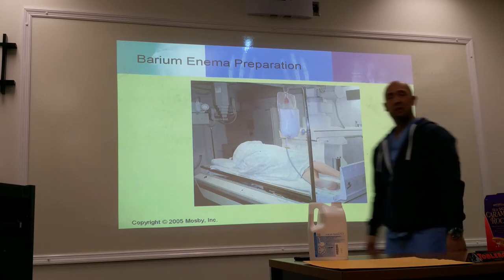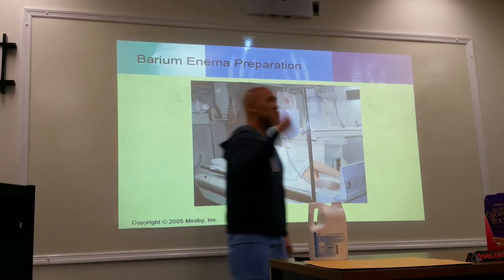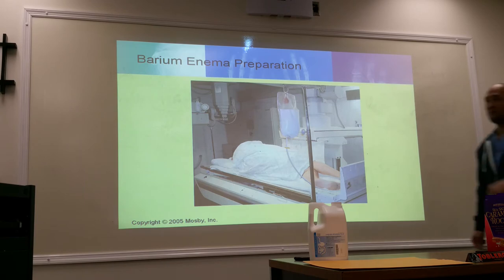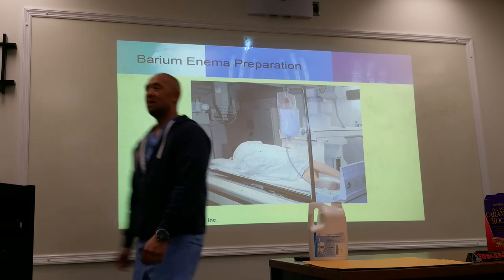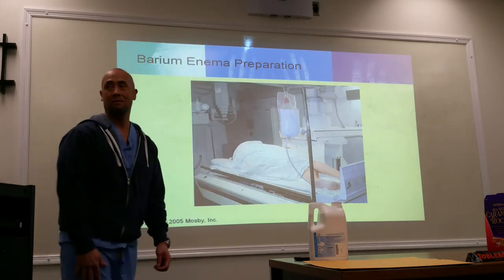Isn't it easier if you just pinch the tube? Yeah, you can do that. But are you really completely clamping it off? I've done that in the past too, and sometimes you can see that barium still trickling in. But do as they do. Yeah, do as they do.